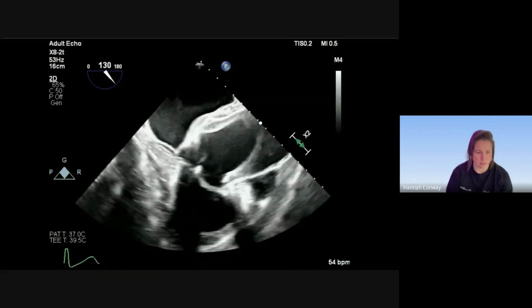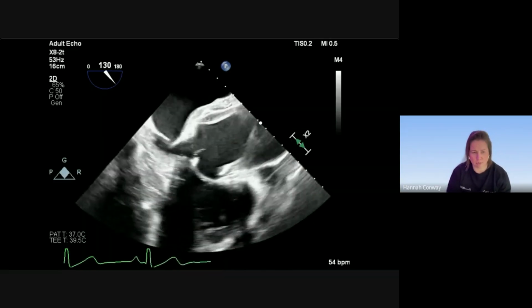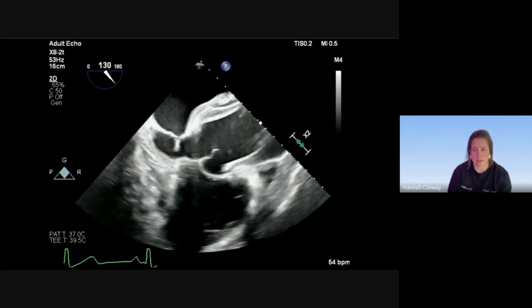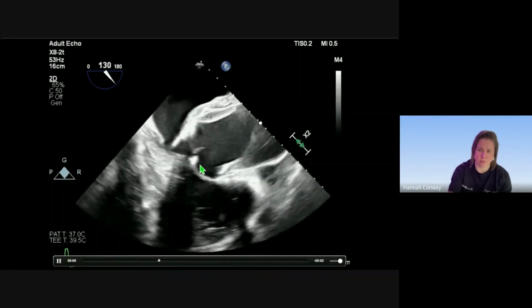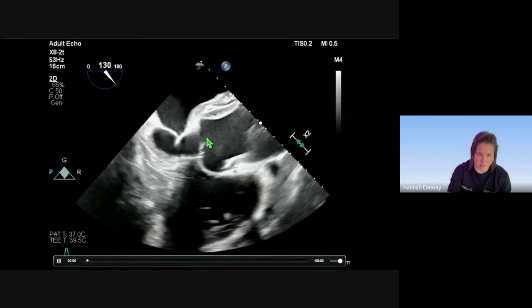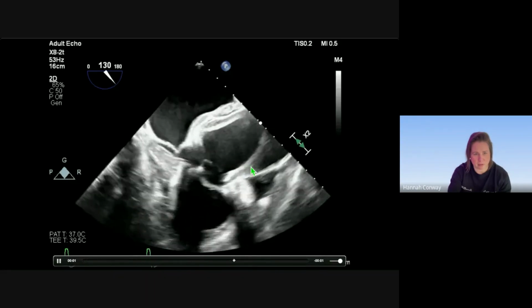So now we can focus on our aorta. Again, as I said before, we can sometimes get a lot more helpful guidance from TOE than from a poor quality CT that's been taken in an emergency. As we can see here, we've got the aorta, and here we've got our annulus, and the sinuses of Valsalva here. So really just above the root is the origin of the flap. And that's really helpful.